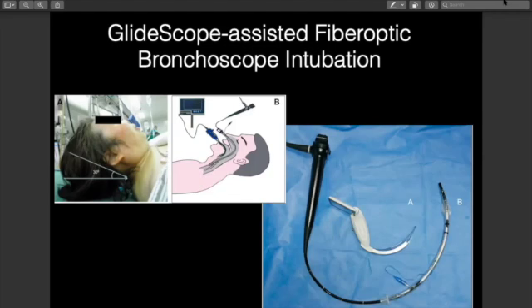Because what we've noticed is that a lot of reintubations occur in these obese patients in the PACU. And in the PACU, you don't have your machine there. You don't have all your blades and tools and drugs. The patient's probably hypercarbic and flailing around, and now you're at the foot of the bed instead of the head of the bed. So you're much better off reintubating in the operating room than in the recovery room. So a lot of big centers now have policy that you stay in the operating room until you're sure that the patient is exchanging well and they're not becoming hypercarbic and that they don't need some BiPAP.